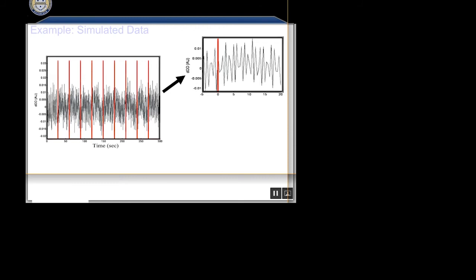And that's because you don't have enough blocks to get rid of these cardiac noise oscillations. If you had enough trials, eventually it would go away because it would average to zero. But for a limited number of trials, which is the entirety of all the work we do, it doesn't go away yet.